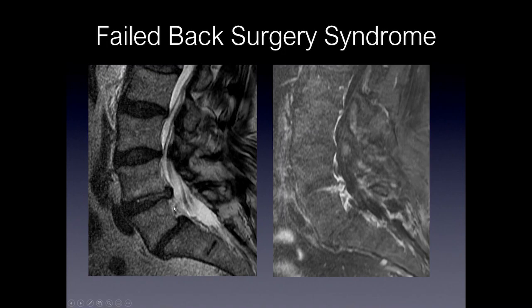It's important to be aware that disc can enhance, particularly if you do delayed imaging. In this patient, the post-contrast images were delayed by about 20 minutes. What looks like a disc herniation with continuity from the native disc on T2 — clearly a disc protrusion — shows enhancement on the post-contrast images due to delayed imaging. So timing is important: if you image immediately, disc should not enhance, but if you wait, the disc can enhance.